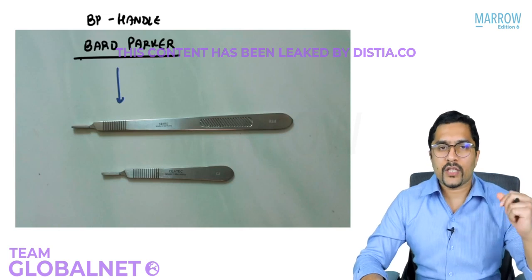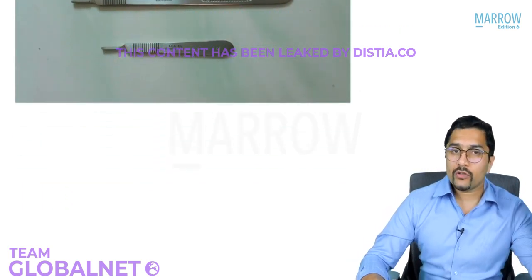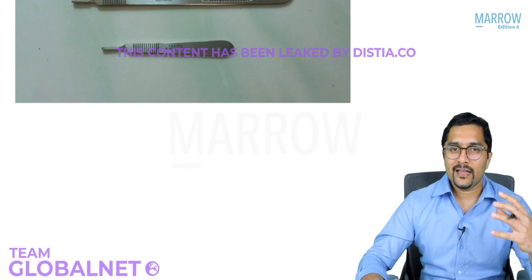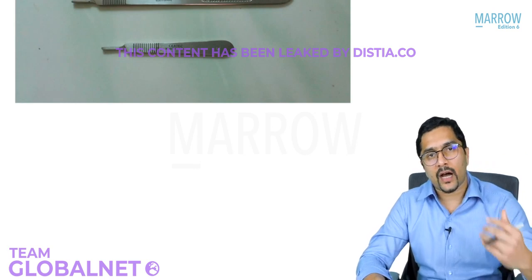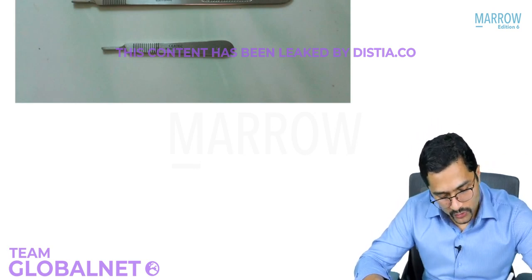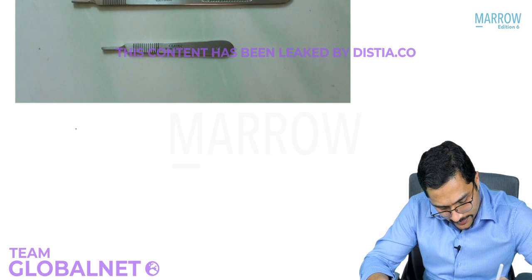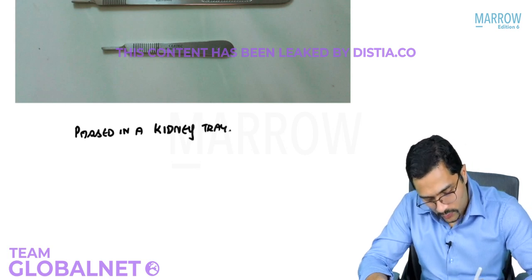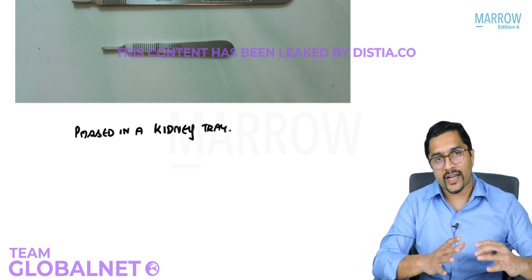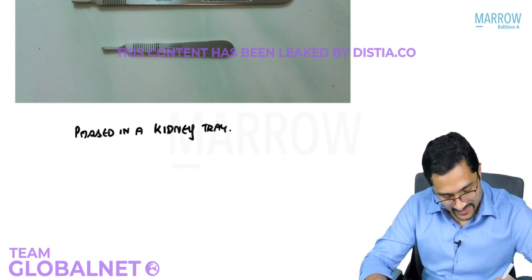Now, there are certain things which I want you to remember, which are very important from the MCQ point of view. I told you in the previous module also that patient safety and surgeon and staff safety is of utmost importance these days, and a lot of questions are being asked around these points. So you should know that whenever you mount a blade, the blade should always be passed in a kidney tray. It should be passed in a kidney tray to avoid a sharp injury. And I will show this to you. I will show videos to highlight all these points. I'm just writing them down, and then I will give a practical demonstration so that you can remember it easily.